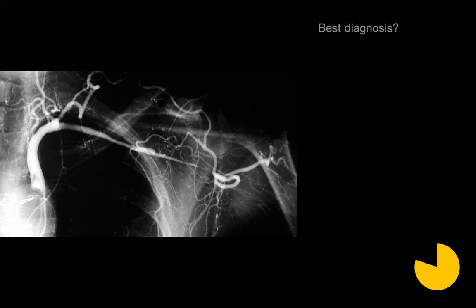What's your best diagnosis? The best diagnosis in this case, where we have severe diffuse stenosis of the right axillary artery, diffuse stenosis of the left subclavian artery, and severe diffuse stenosis and occlusion of the left axillary artery, would be giant cell arteritis.